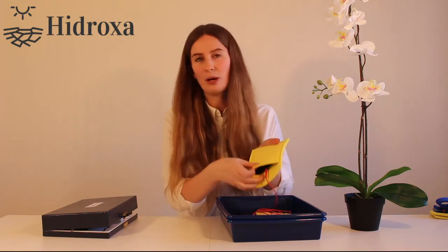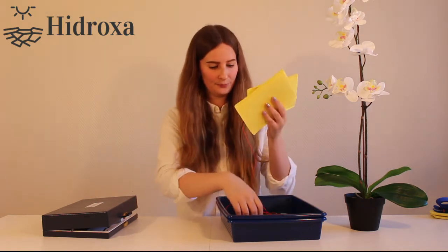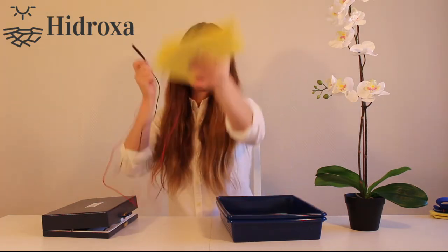Let's start with the larger electrodes. Inside each electrode pocket there's a rubber electrode. The electrodes are already inside when you receive this package, but please make sure that the cables are fully inserted in each electrode. Take the black and the red cable and connect them to your device.